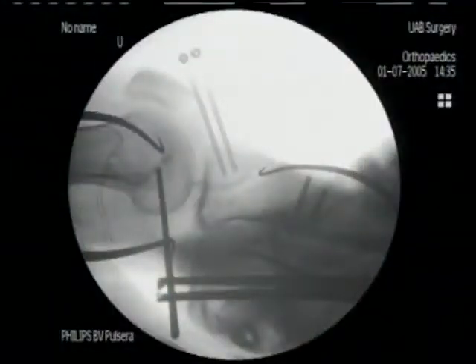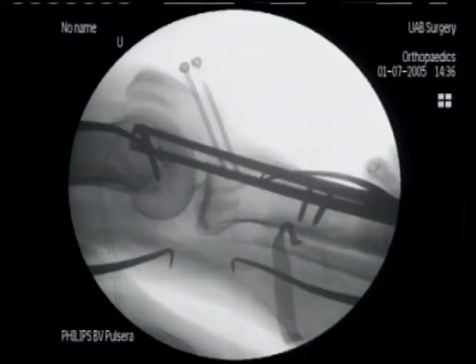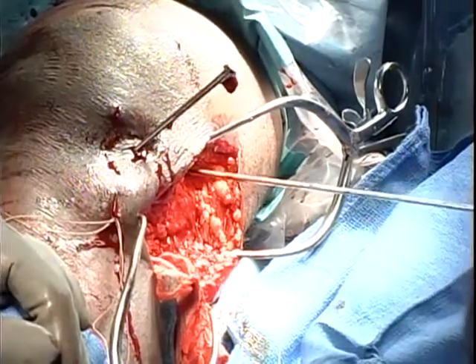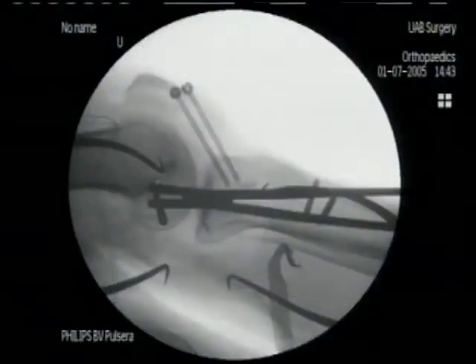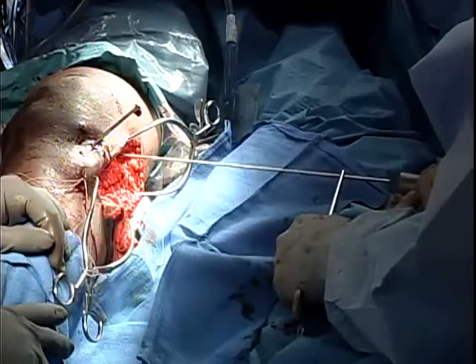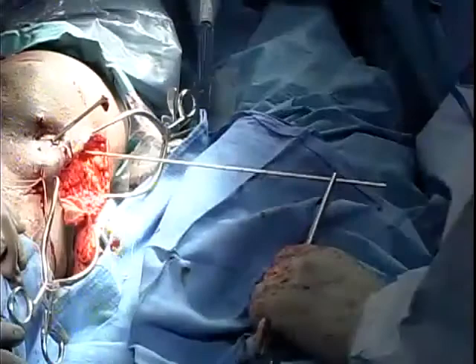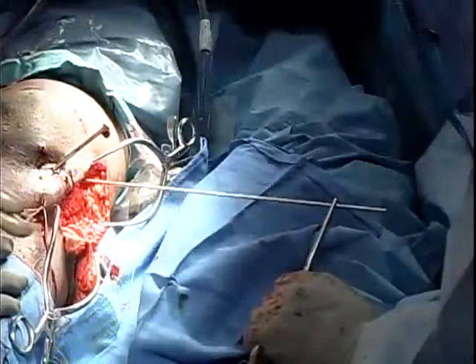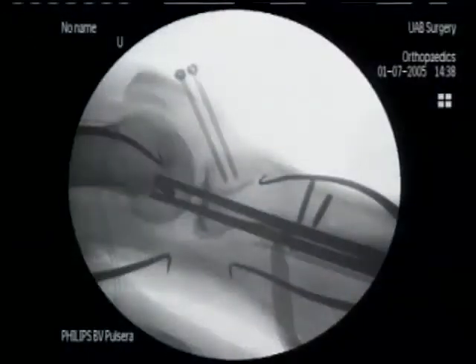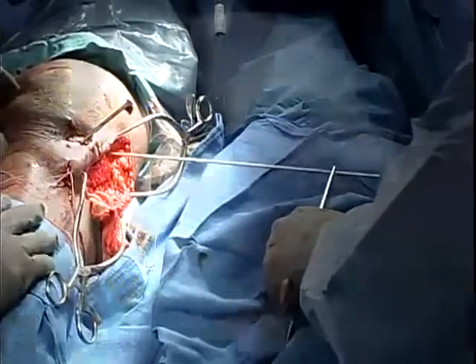Confirm tip position, then move it anteriorly and posteriorly to verify a good lateral view. Once satisfied, drop the tail of the wire down, trying to make the reference wire look like a dot rather than a long wire. Make fine adjustments — raising or lowering as needed — then tap it into the cortex. Continue refining until it appears as a dot on fluoroscopy. Tap it in further so the coker can be removed for a cleaner view.